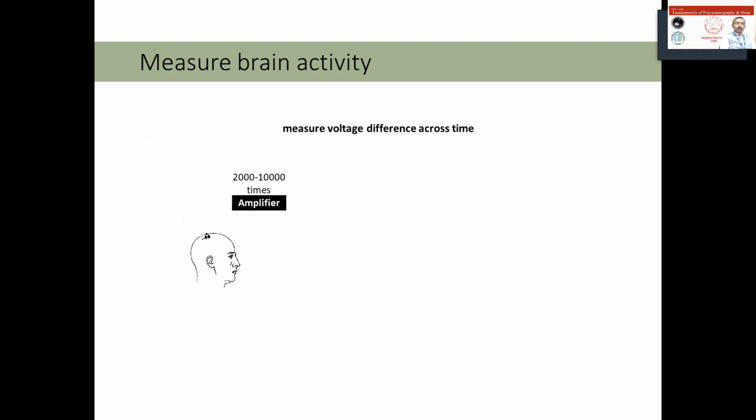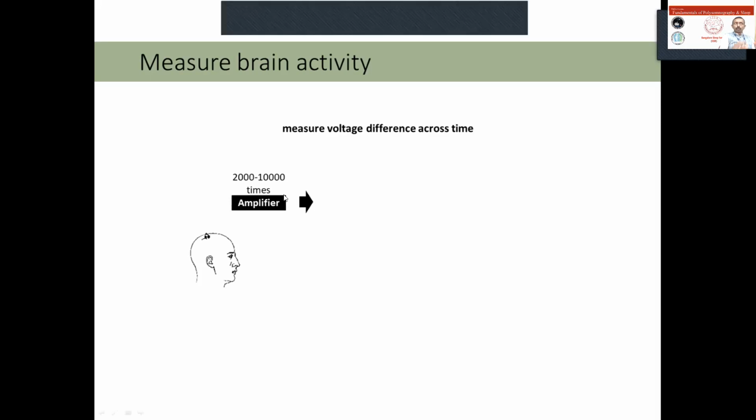The voltage is very small in brain signals, and even eye signals are in the range of microvolts, which is about 10,000 times lower than a volt level. Many devices require the signal to be in a slightly higher range. So you need an amplifier to increase the signal to a level that the device can start interpreting. So that's why we need an amplifier, and the amplifier alone is not enough.